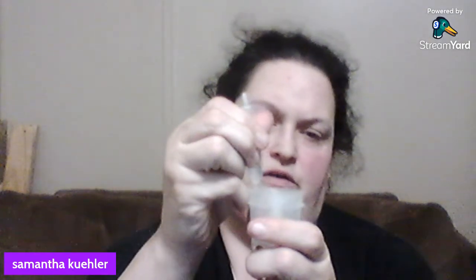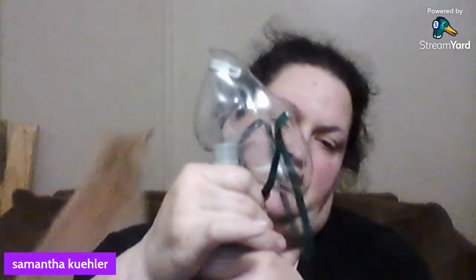Nice, lovely, sterile stuff. So we take the top of our mask off. Take our little tube and we go twist, twist, twist, and now the top is off. We put that to the side, and then we take our tubey tube and squirt all that lovely liquid, our Breathe Good liquid, into the medicine cup. Then we set the empty tube aside, put our mask back on the medicine cup, and then take the mask. And then we have Breathe Good magic.